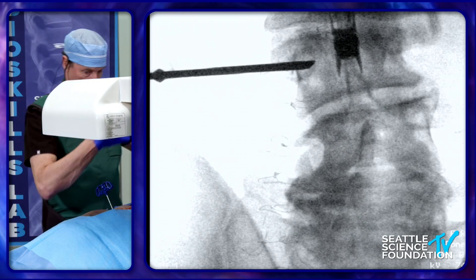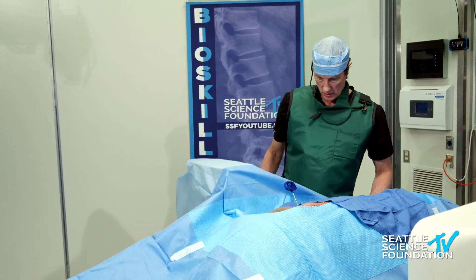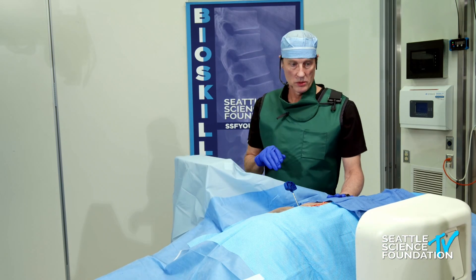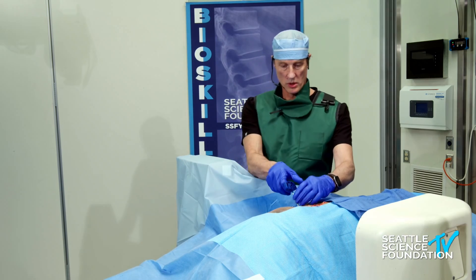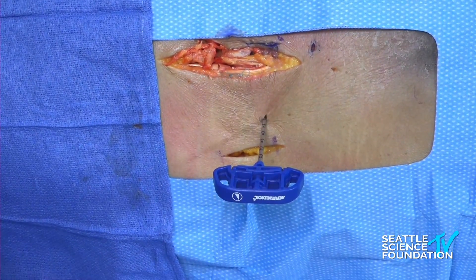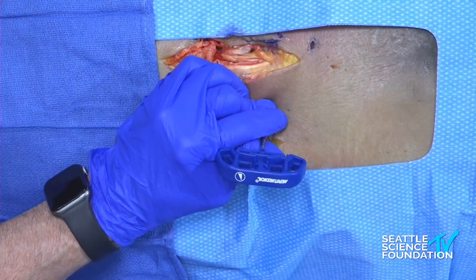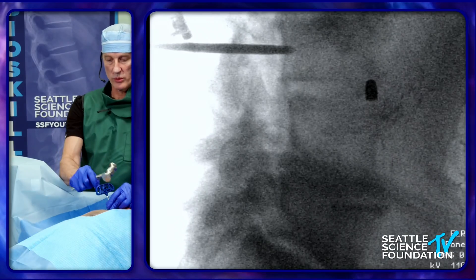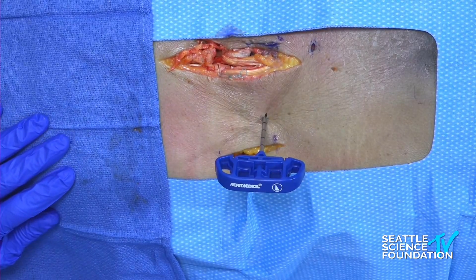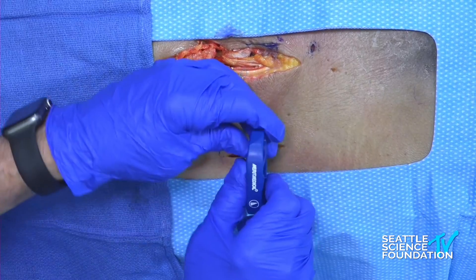Let's go lateral. So I'm going to turn the bevel away — we're just a couple millimeters away from that posterior wall — and I turn the tip back toward me. A couple of easy taps to make sure through the posterior wall, then turn it back directly medial. We don't really need to direct it much more medial because we do have a steerable system — it's called the power curve.